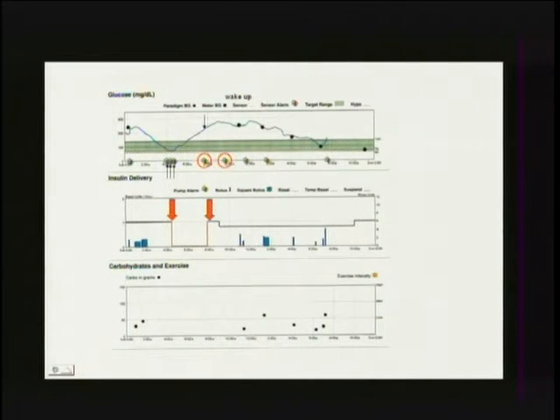But I see everything. It's not looking at the blood sugars. I'm looking at how these people are thinking. It's actually kind of scary. But with this download, we can do that, and we can see exactly how they're thinking.